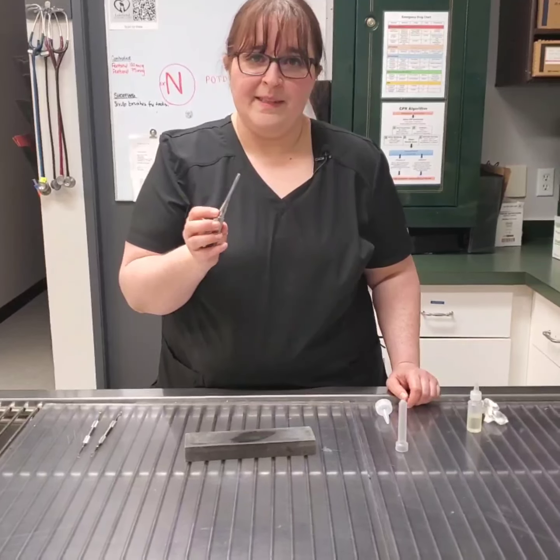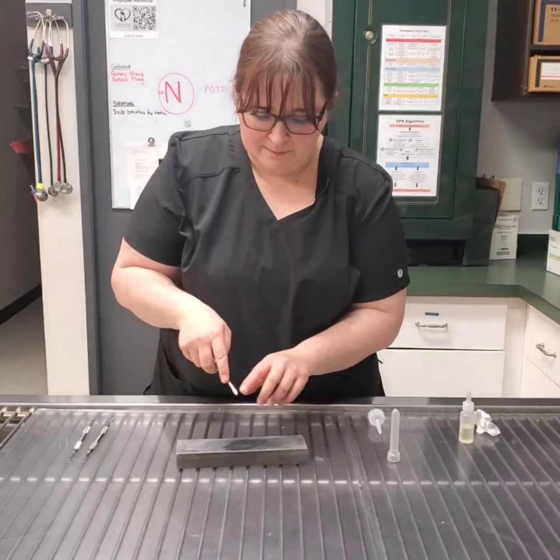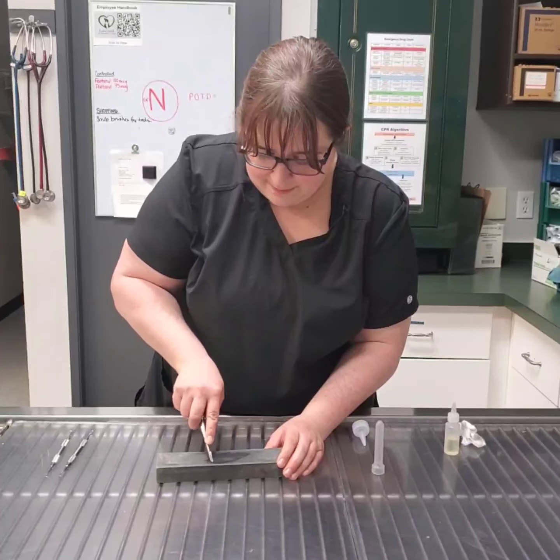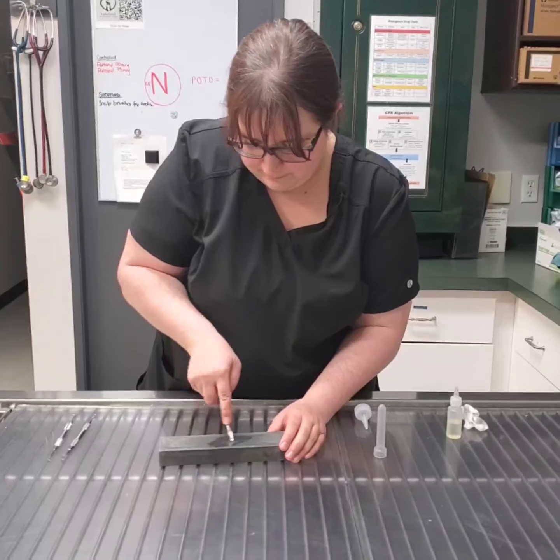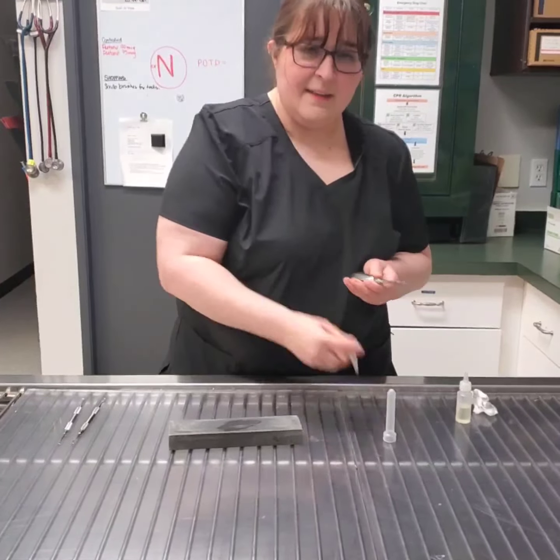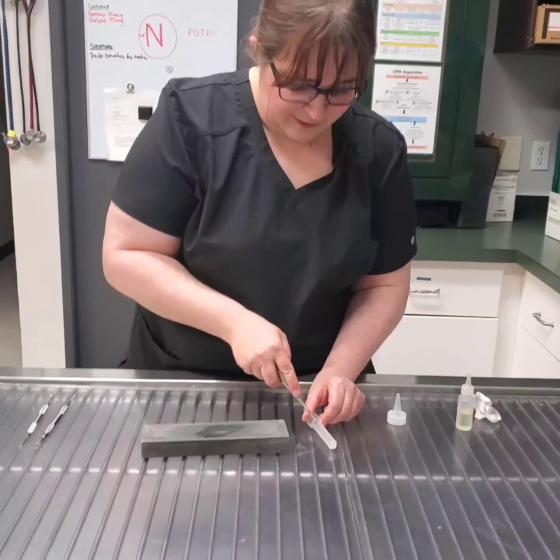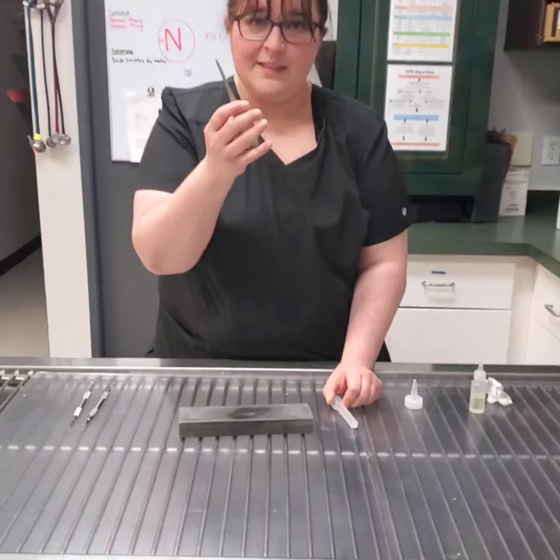So now I'm going to be sharpening the elevator. I've already applied the oil, and we're going to be holding it with the concave edge out, and I'm going to be holding it at roughly a 45-degree angle, and I want to make a smile. So I want to rotate, and I want to get a good smile motion. And then I would take my conical sharpening stone and I would get rid of any burrs or anything that way. And I'm going to check to make sure that it's sharp. And you can see there, it digs in, it doesn't want to slide, so this is a sharp elevator.